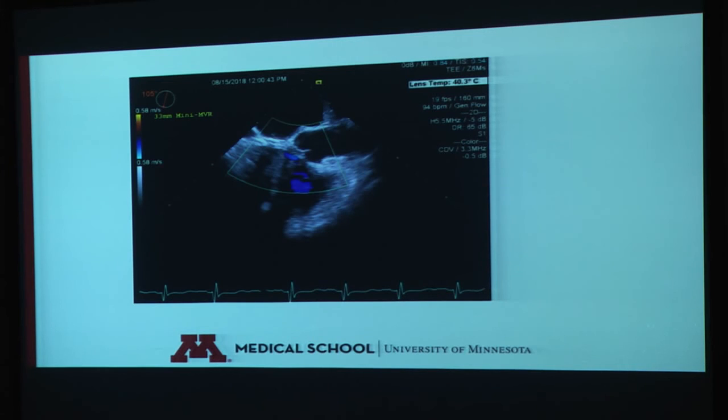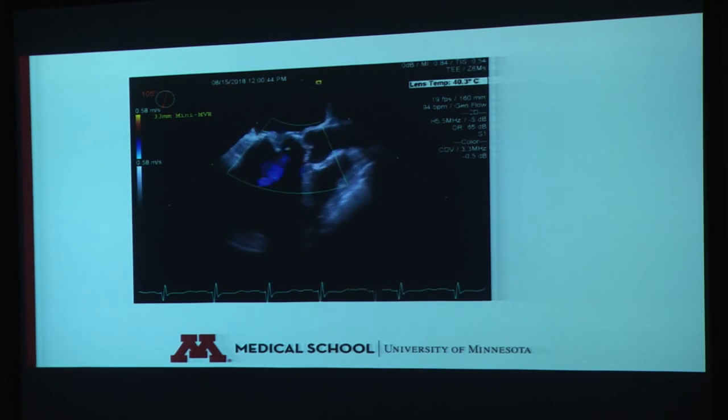So when they were trying to assess color in the long axis view here, you can see that if you were trying to look at aortic regurgitation here, there's really not much that you can see on the LVOT side of the aortic valve. So that becomes a problem with the acoustic shadowing when you're trying to look at something like that.